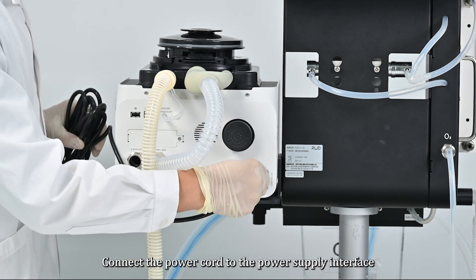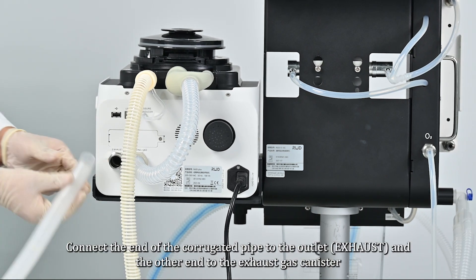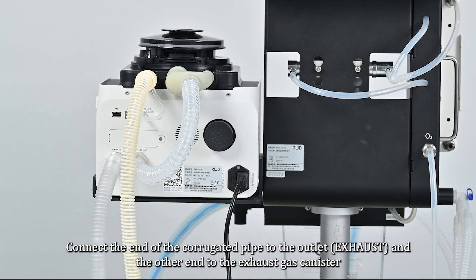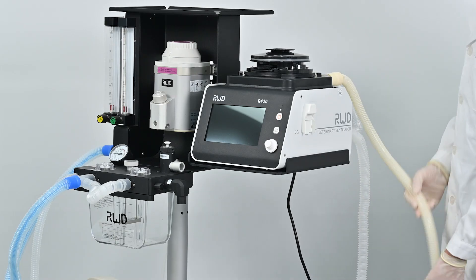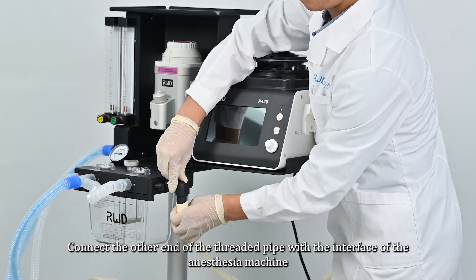Connect the power cord to the power supply interface. Connect one end of the corrugated pipe to the outlet and the other end to the exhaust gas canister. Connect the other end of the threaded pipe with the interface of the anesthesia machine.